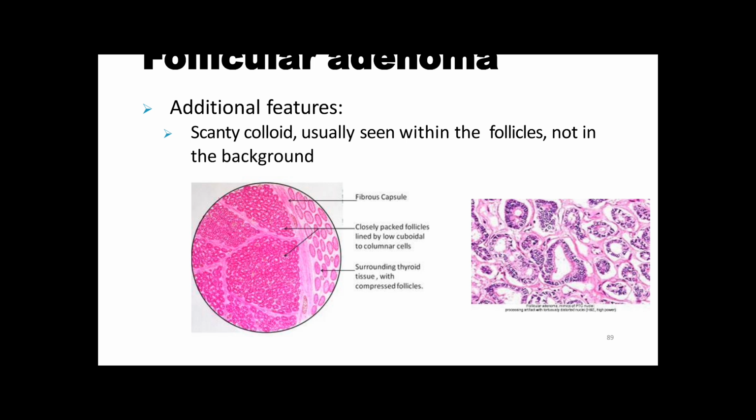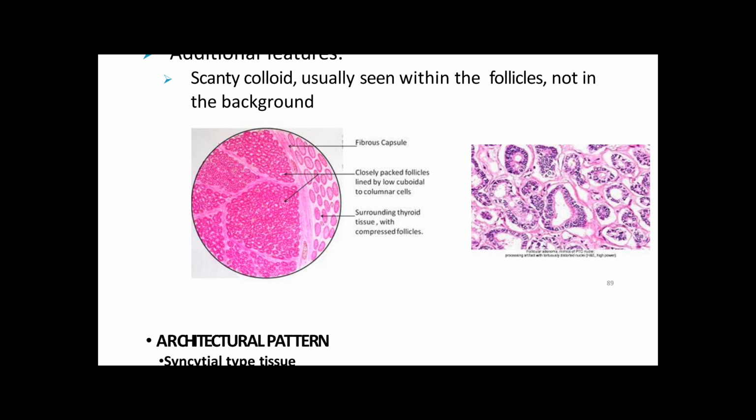So inside the follicle we can see the scanty colloid, but not in the background.